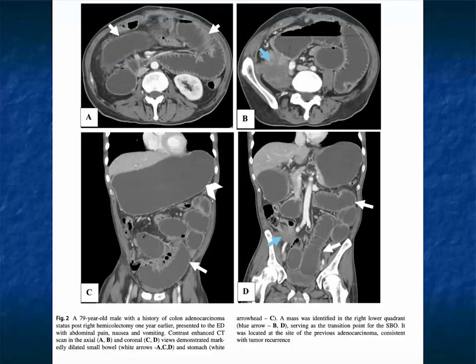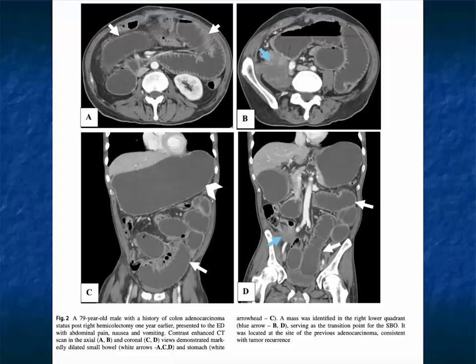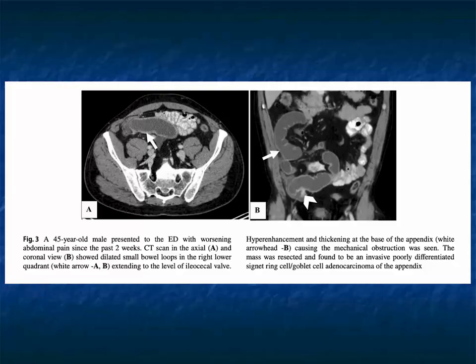In another case, the patient had a history of colon cancer with a right hemicolectomy a year earlier and now presents with abdominal pain, nausea, and vomiting. You worry — could this be adhesions, recurrent tumor, appendicitis, or many other possibilities? This turned out to be tumor recurrence at the site of the prior adenocarcinoma, and you can see it very nicely on the reconstructed images. We have lectures that go into detail about small bowel obstruction and looking for transition points.